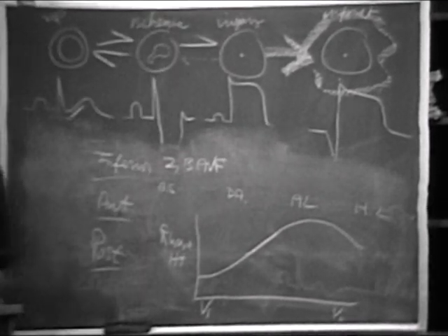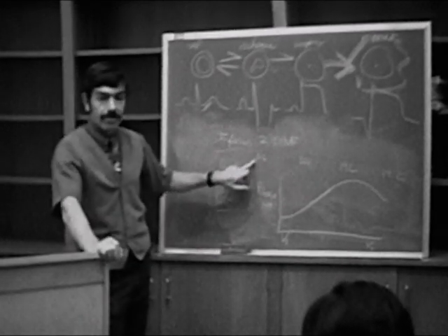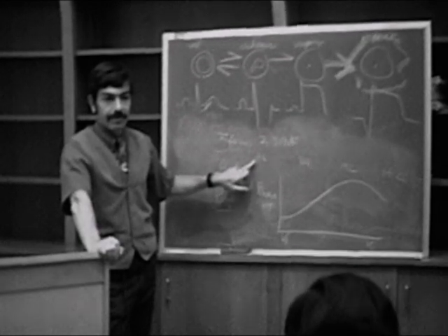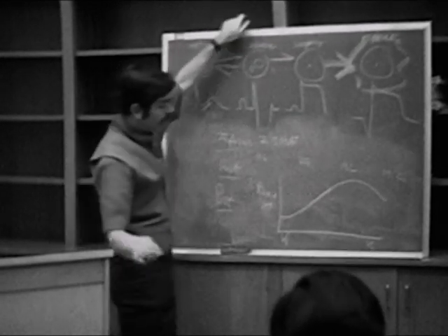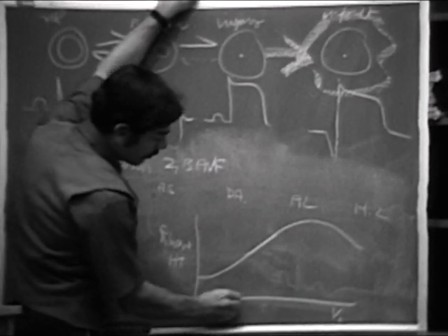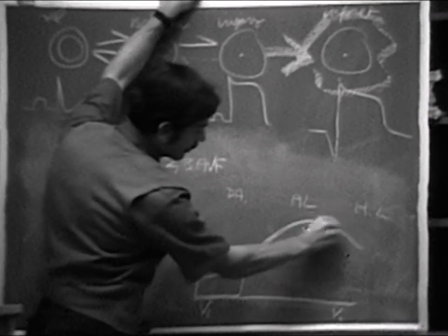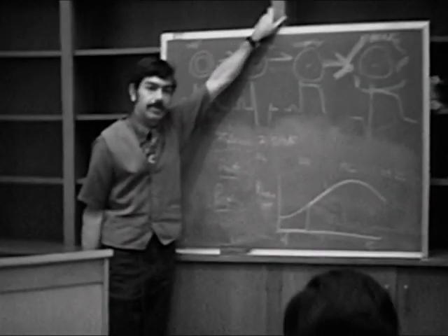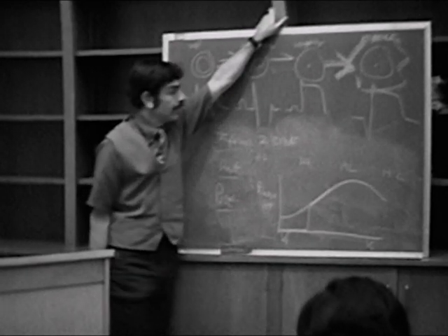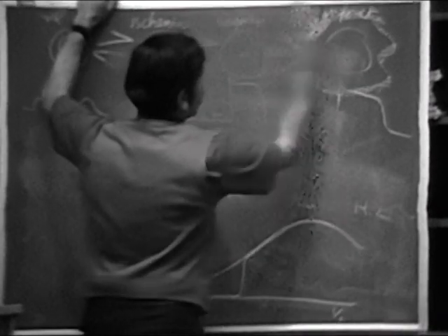And as I said, we want to look at the R wave progression when we're trying to diagnose infarction. Okay, now with an anteroseptal MI, you get an abnormality of the R wave progression. Right? You can see a loss of R waves in leads V1, maybe through V2 and V3, and then after that your R waves would become normal again. All right, so that would be an anteroseptal MI. Let me erase this here. Maybe I can illustrate this a little bit better.